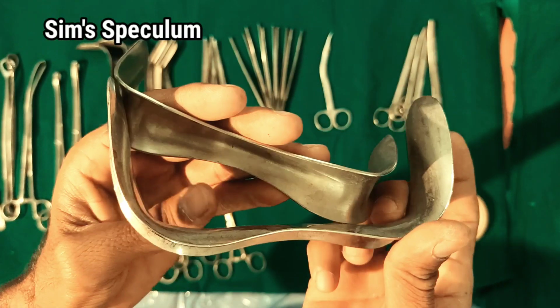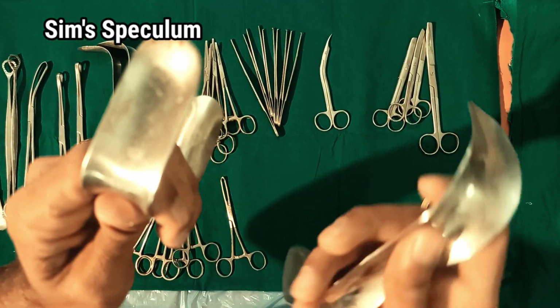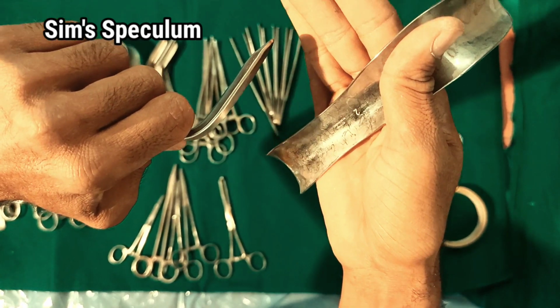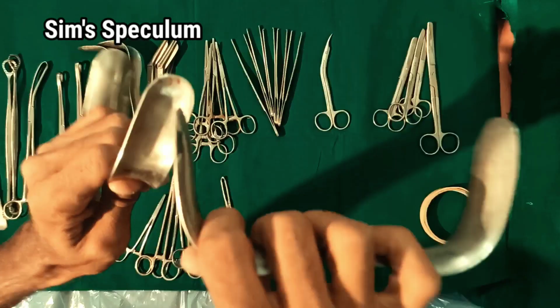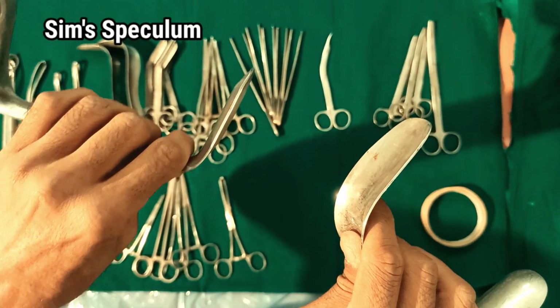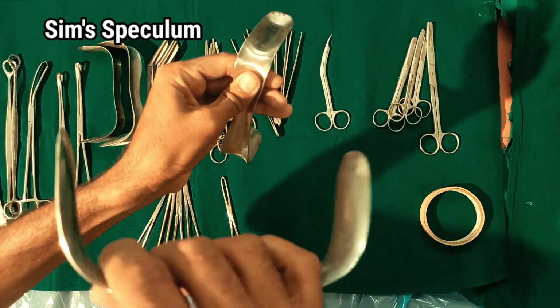Since the speculum is inserted into the vagina to retract the posterior vaginal wall, it gives more exposure of the vaginal wall than Cusco speculum and therefore is preferred for gynecological surgeries. It is possible to slide the instrument around the vaginal wall to enable better visualization.